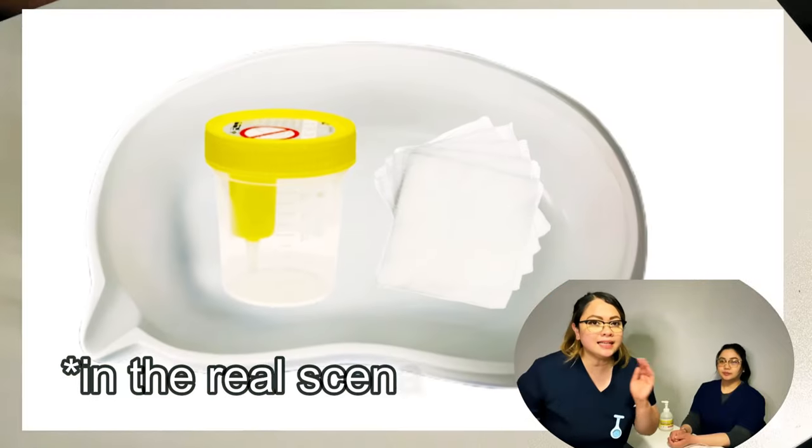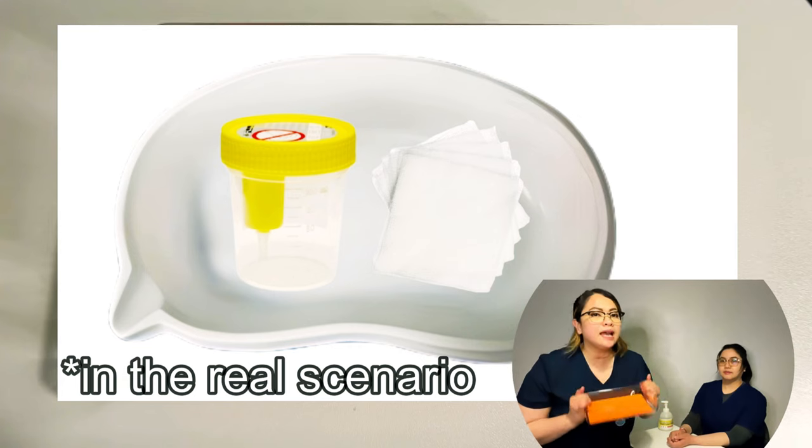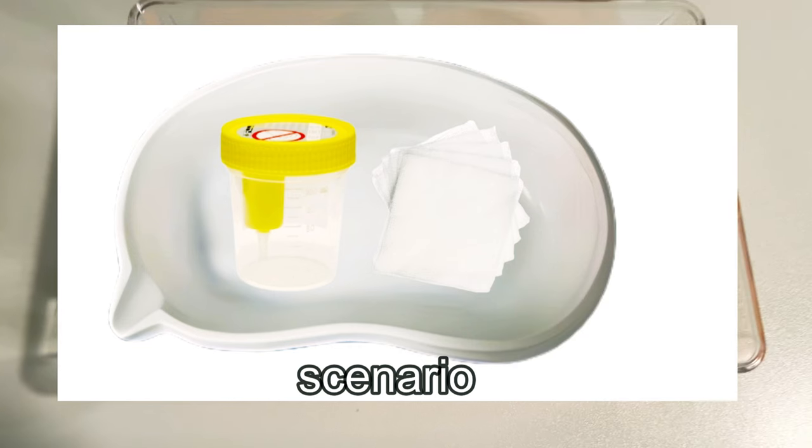So probably in the examination center, you're going to be having a disposable tray, okay? At the moment, I am using a non-disposable tray, okay?